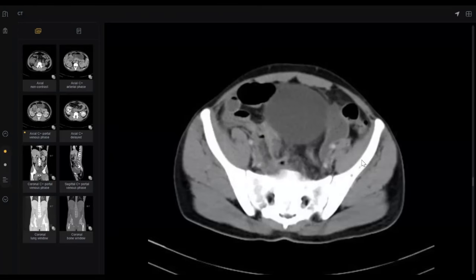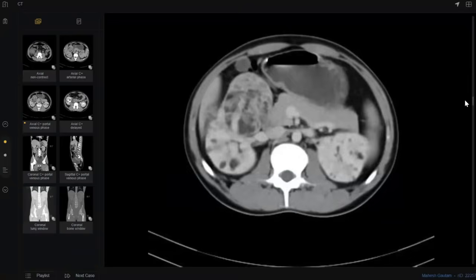I tell you something very important. Don't panic when angiomyolipoma is presented in the exam in a atypical scenario. Why? In my first viva, the examiner gave me two sequences, in and out of phase only, and it was a very small signal drop in both kidneys, very small bilateral.